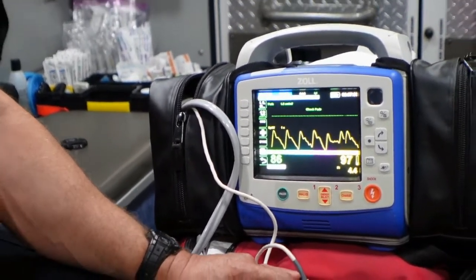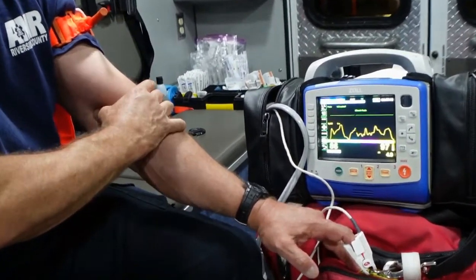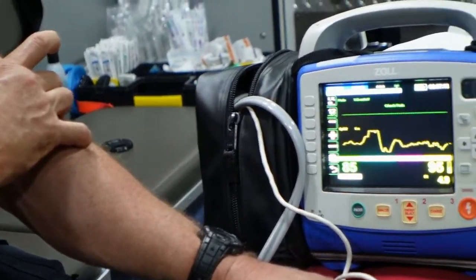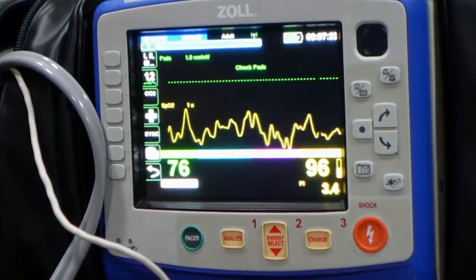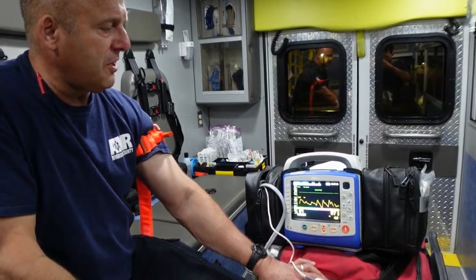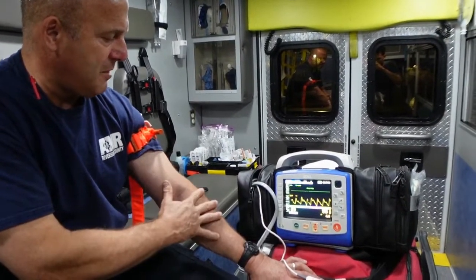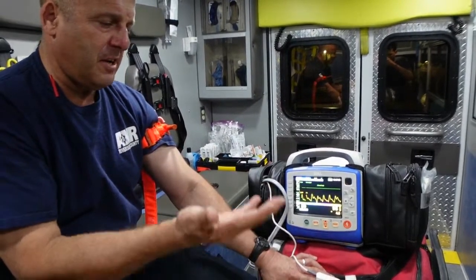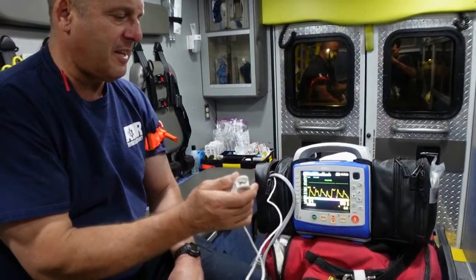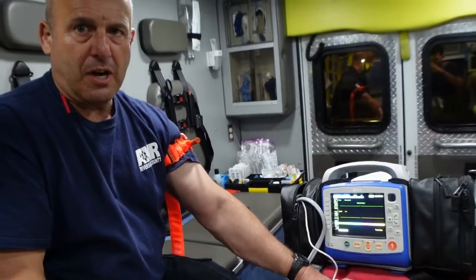A couple other things I could do with this — if you find the brachial artery, find the bicep tendon on the inside and just push in. I'm squishing my brachial artery, and you can see that's affecting distal circulation as well. If you're going to use the Pulse Ox to check distal circulation, it's really important to establish a baseline norm. For example, say I have an injured or fractured or burned left arm — I want to start with the unaffected arm and make sure I have a good Pulse Ox reading. I should be able to get the same reading on both sides. If I put the Pulse Ox on the suspect arm and the reading is garbage or all over the place, I know I have arterial compromise there. This works almost as effectively and accurately as a Doppler.